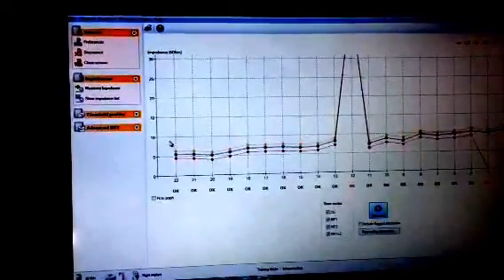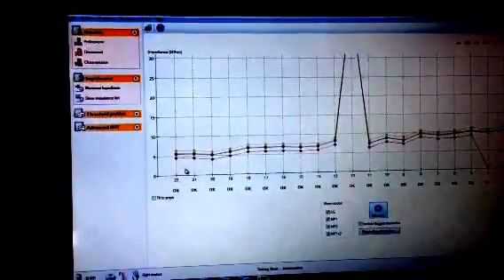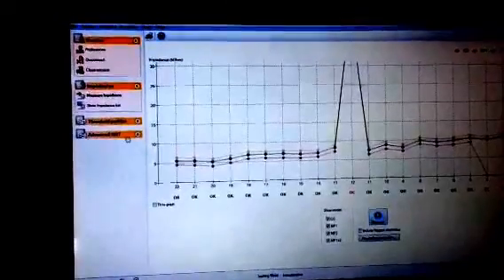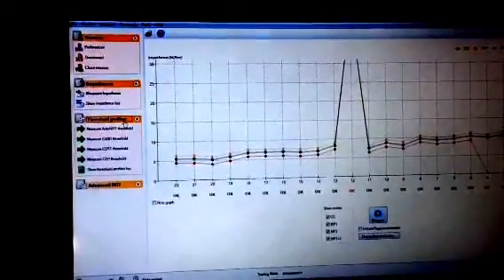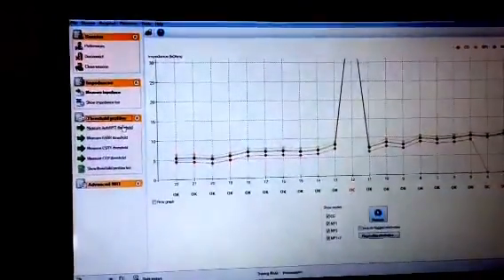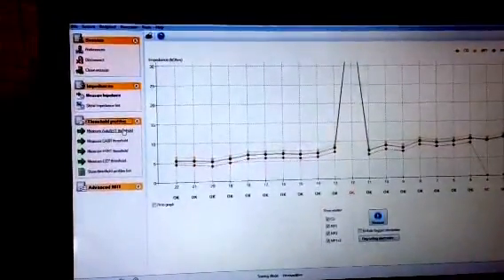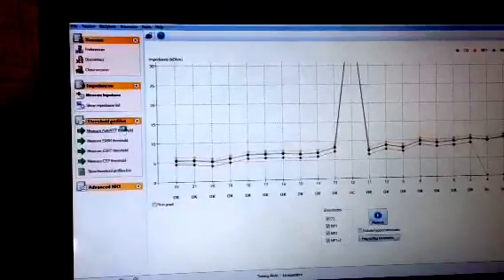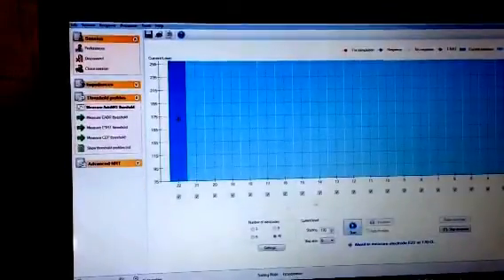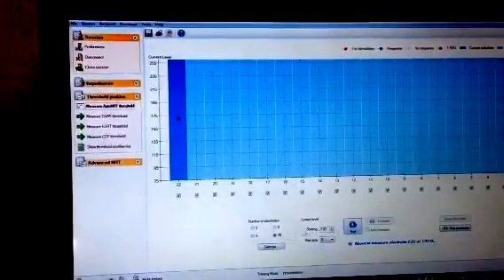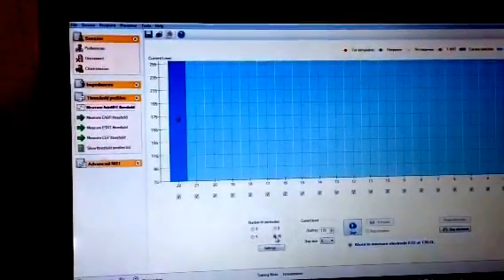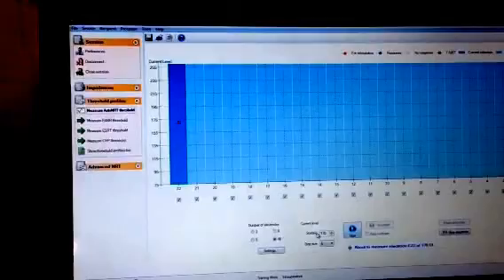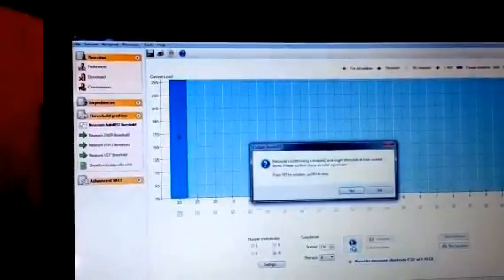After you've done that, the next step that you need to do is measure auto NRT. You will see measure auto NRT. You are doing it on all channels, your starting level is 170. All you need to do is press start.